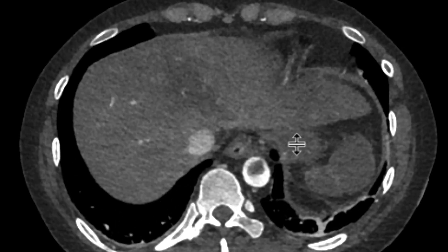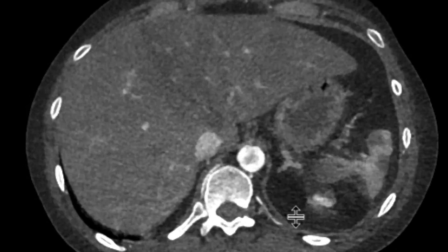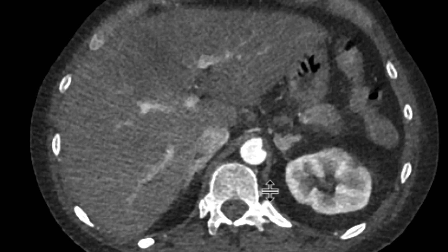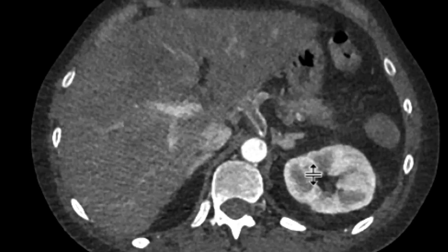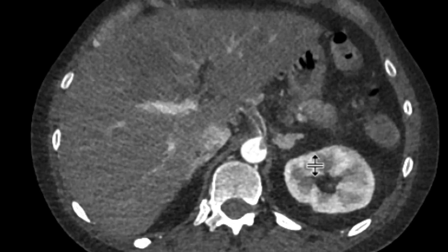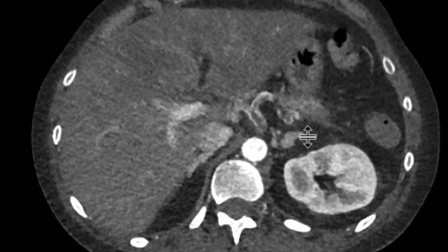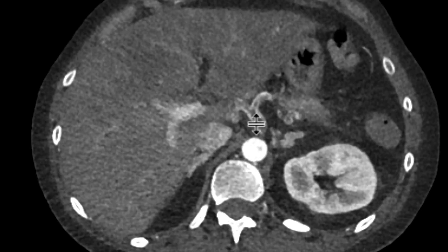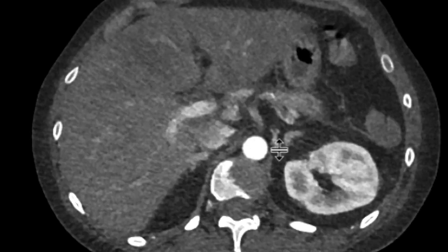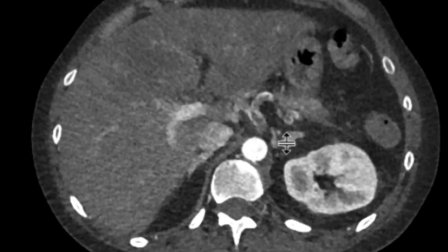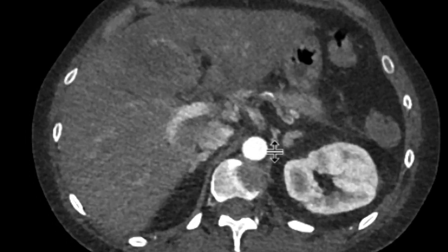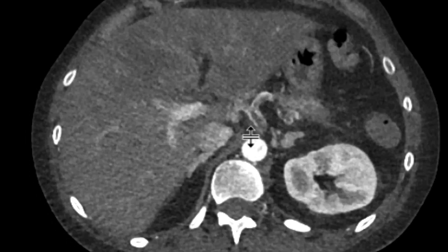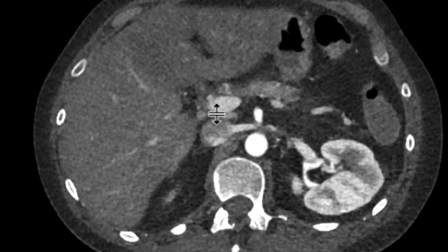Looking at the arterial portion of the study, we can see the thrombus again very nicely in the distal descending aorta. A portion of it is extending into the abdominal aorta and into the celiac artery. Look at that large filling defect — it goes into the splenic artery and follows it for much of its length, resulting in that splenic infarct. It also extends into the common hepatic artery, though it's tough to follow beyond that.